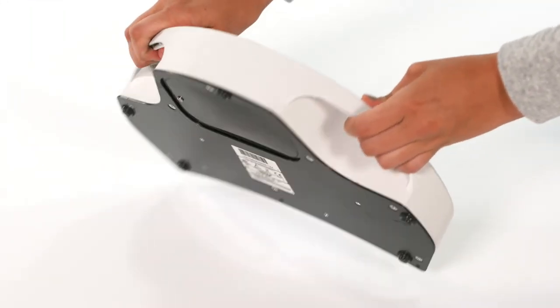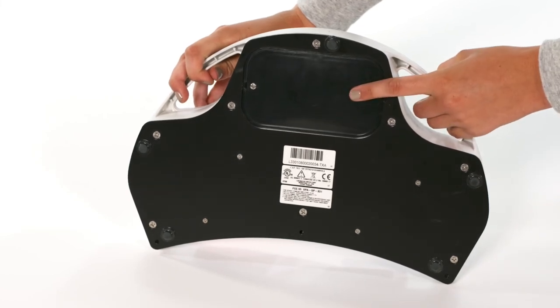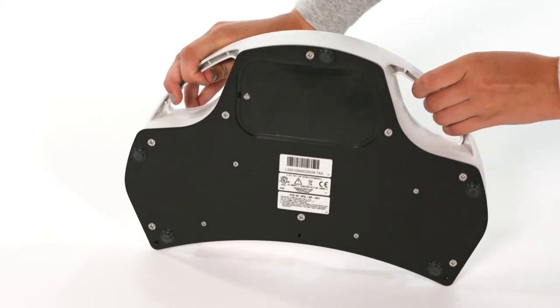If the foot pedal is not taking images, it is likely time to change the batteries. Change them and try again.